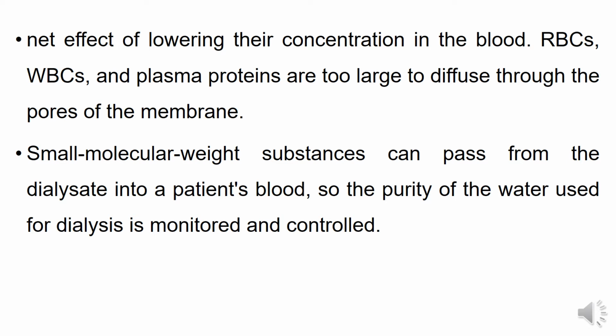So the purity of the water used for dialysis is monitored and controlled, otherwise there may be a chance of infection to the patient. Higher molecular weight substances may not pass through the membrane.